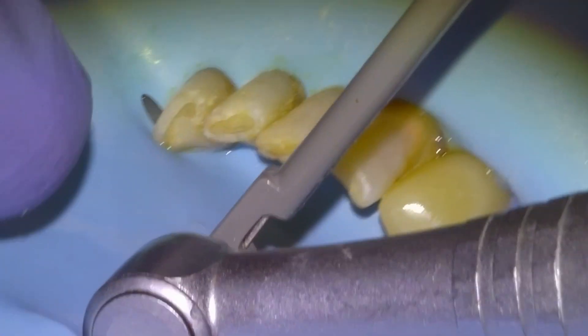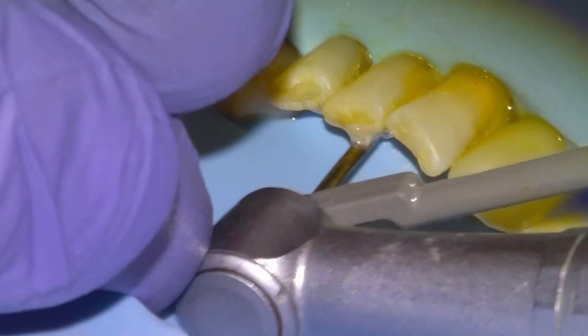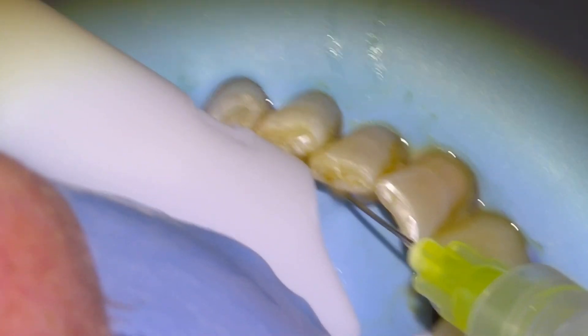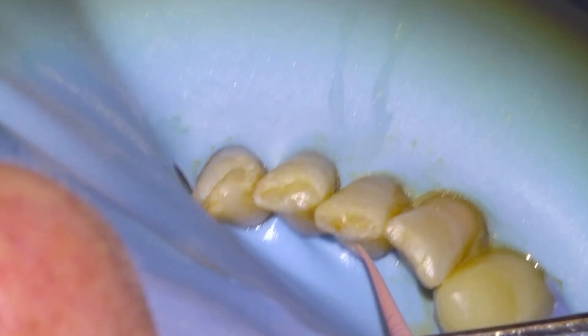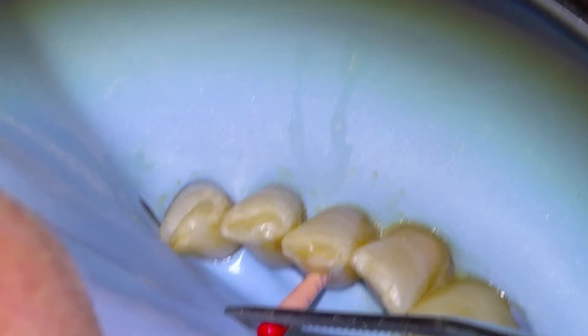Then we'll take our 35-04 to length, and that'll be our last file before we dry and obturate. We'll irrigate and activate one last time and then take a master cone fit x-ray to verify the length of the cone.